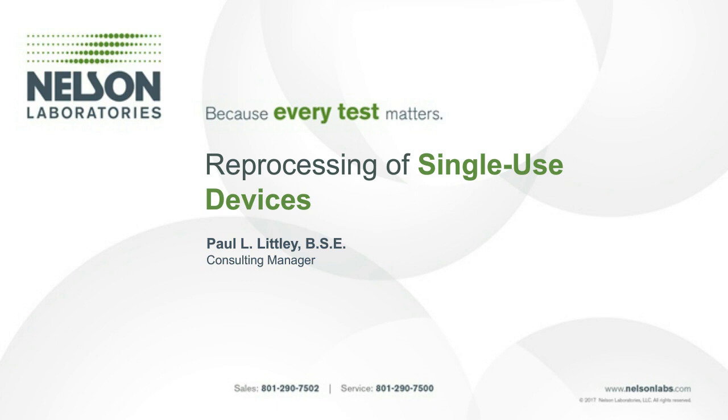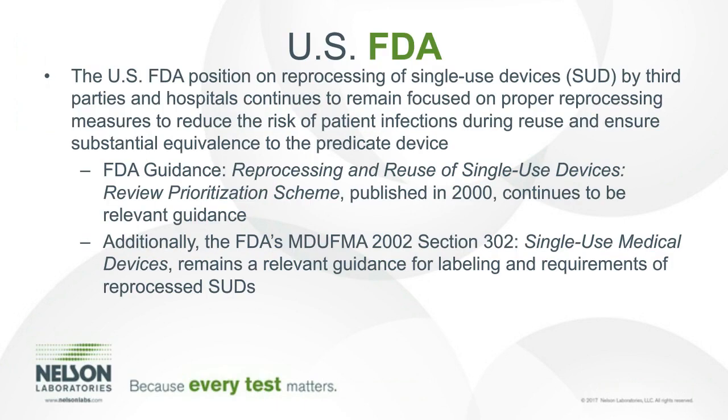Thank you, Alpa. In the final section of today's presentation, we will discuss industry updates and trends for the reprocessing of single-use medical devices. For clarification purposes, a reprocessed single-use device, by definition, commonly refers to an original device that has been used on a patient and then subjected to additional processing and manufacturing, primarily cleaning and functionality testing processes of the device for the purpose of an additional single use on a patient.